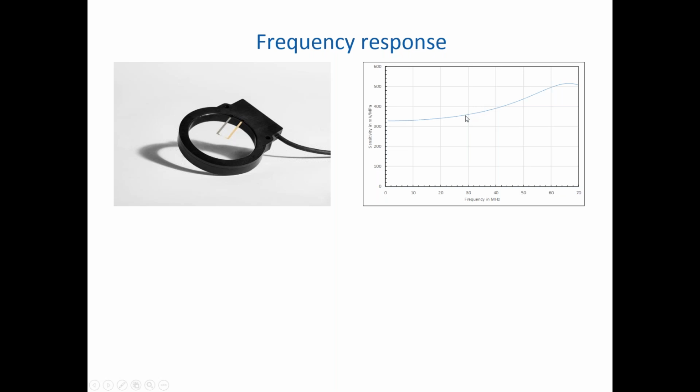So whilst it's going to be important to have this value quantified, because this value could move up and down depending on the sensitivity of the device, we will probably need to make a correction for the frequency dependent sensitivity, but that correction won't necessarily be huge.